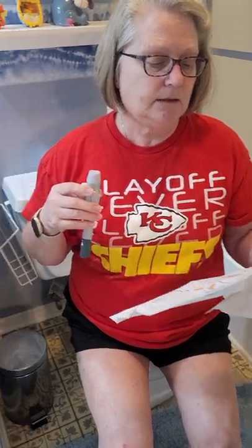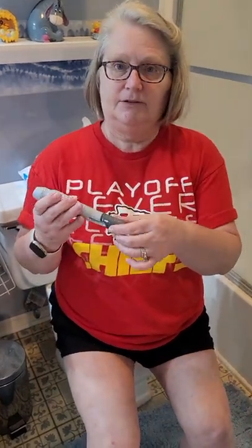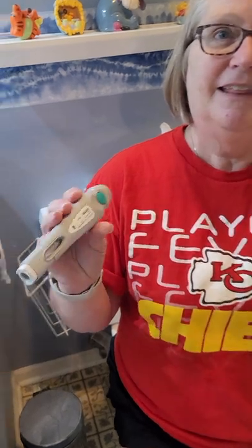These next steps are going to go really quick, so I can't read at the same time. Hold the pin with your fingers on the gray hand grips. Pinch the skin — it's going to be at a 90-degree angle. I'm only nervous because I never take Skyrizi before. So we're going to take the lid off. Ta-da! That was easy.